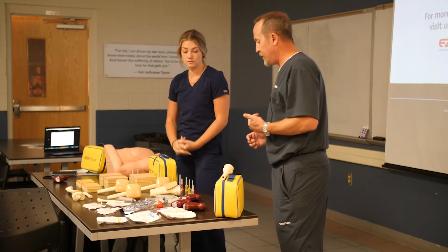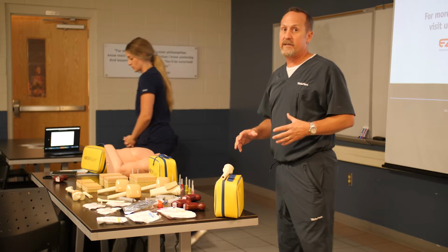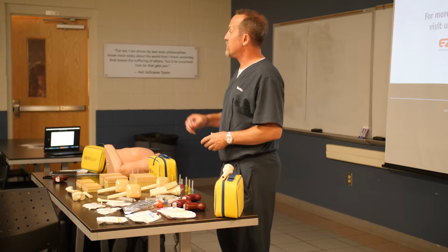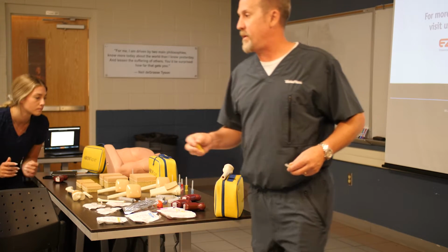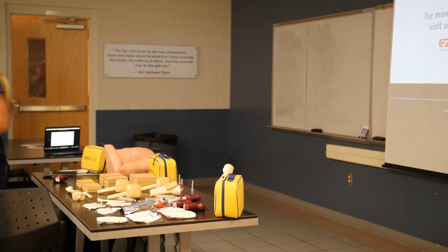Okay, perfect. So I'm going to jump into a little bit about the device and the supplies that you guys have, needle sizes and things like that. First and foremost, I'm going to go through the needles, and I'm going to pass a couple around for you guys to take a look at. When you remove the needle cap, I'll let you take a look at that and pass it around.